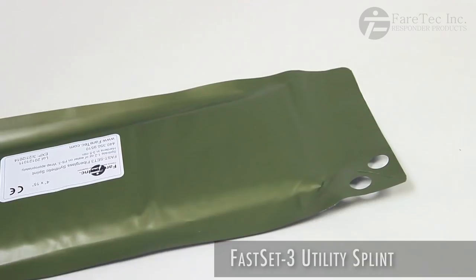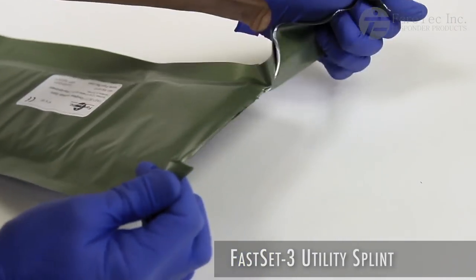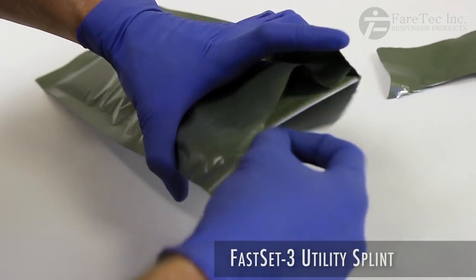The FS3 is easily opened by locating the two finger holes in the corner. Once these are torn apart, the splint can be quickly removed from its packaging.